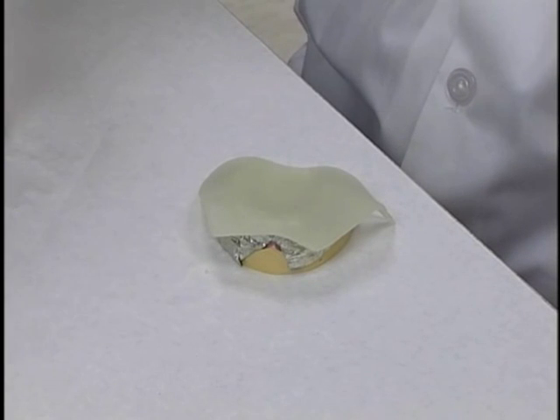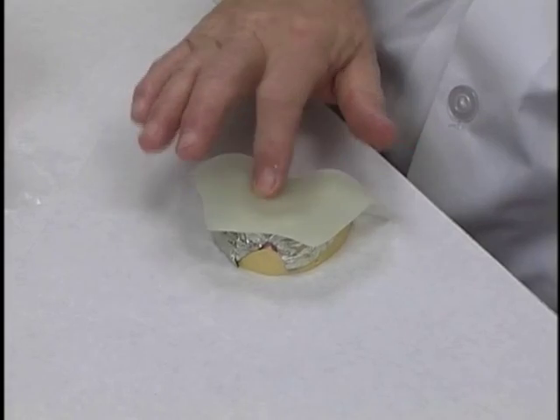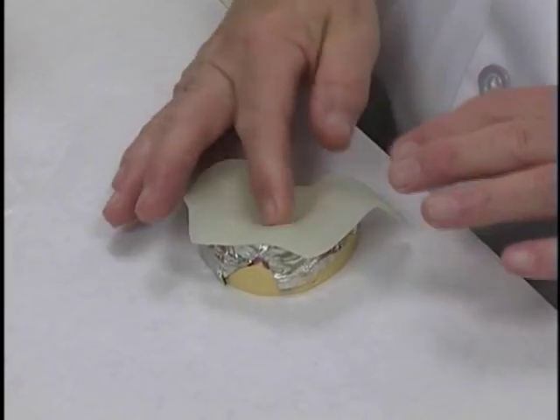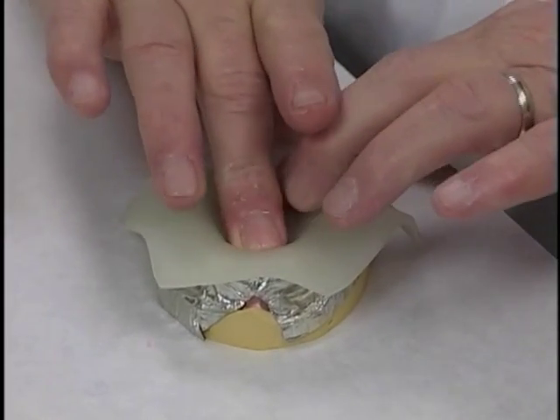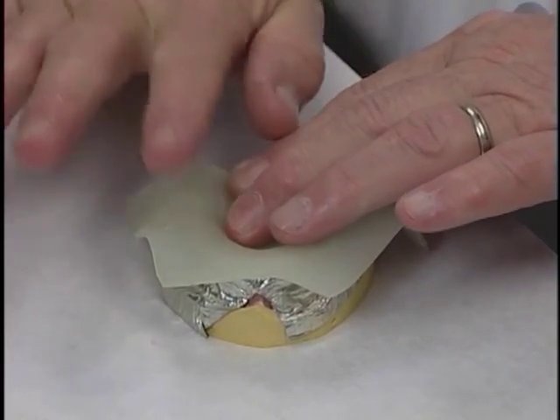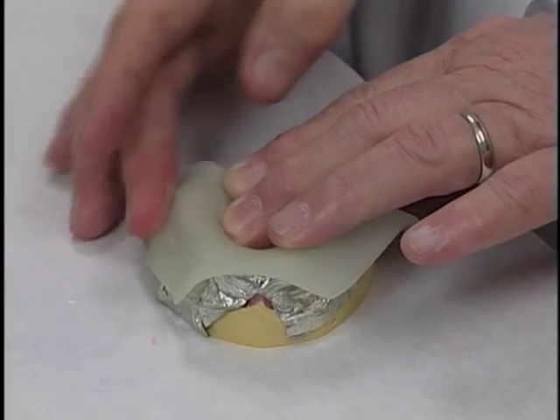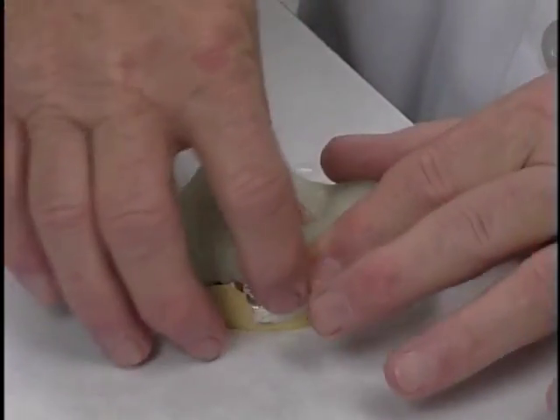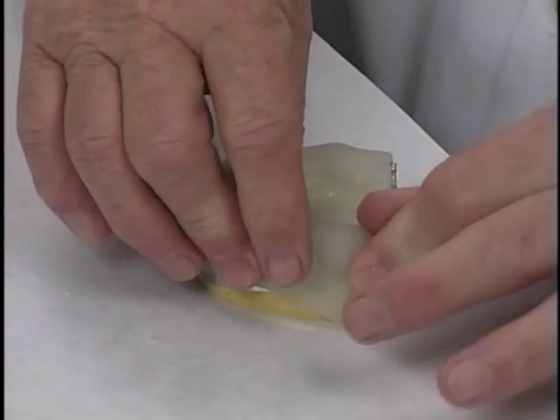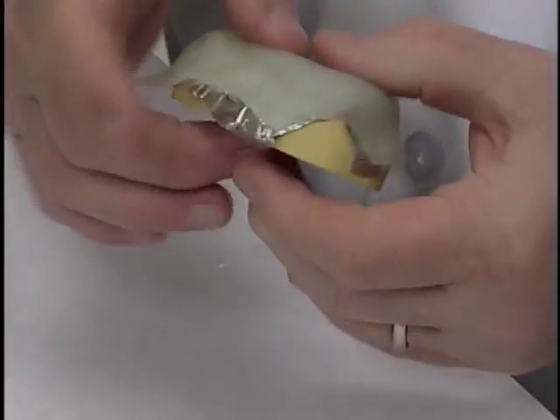In order to keep it from being sticky to your fingers, I usually like to have a little water and keep my fingers moist as we're adapting it. And just very well adapted, I usually start on the maxillary in the palate and then work it down from the palate around the peripheries, from the crest of the ridge, work it down all the way around the peripheries and make sure it's well adapted onto the cast.